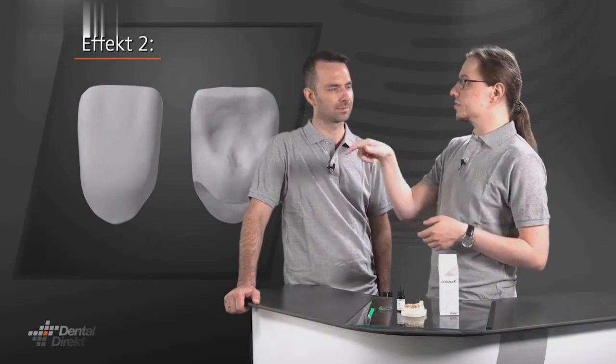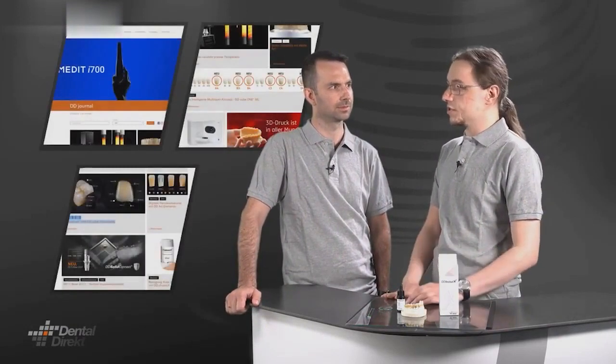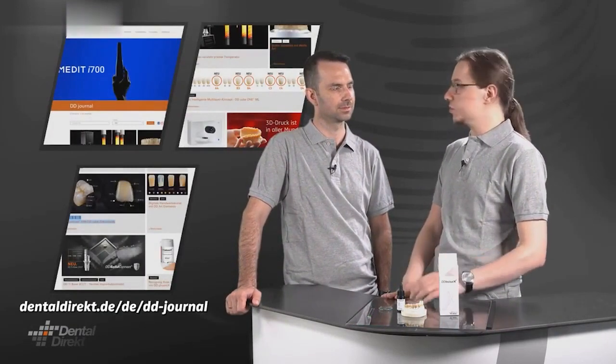That's one effect. And the other effect is we get grain growth. Why is that important? It is well known that grain boundaries cause birefringence, and that creates a less translucent appearance in zirconium. So if we make the grains grow, then we have fewer overall grain boundaries. That means we also have less birefringence, which means we have more translucency. And as you said, this information can of course also be found on our website, right? Exactly, you can find it on the website, and of course all sorts of other things in the journal, including information about sintering and whatever else you can think of.